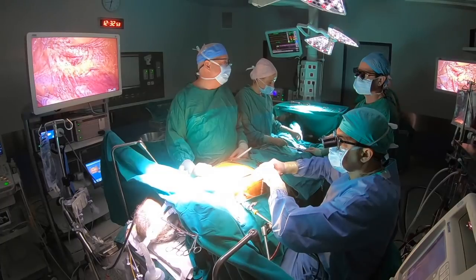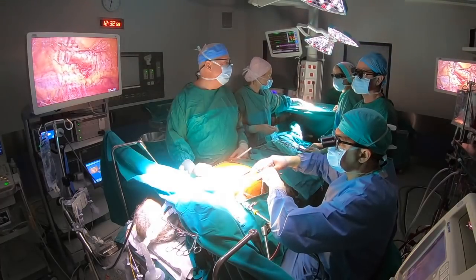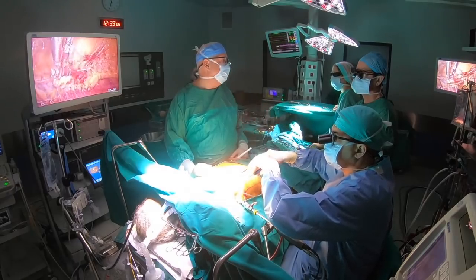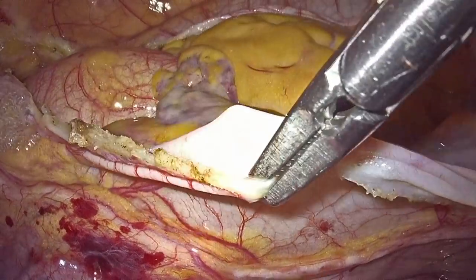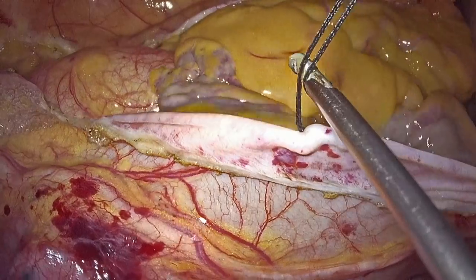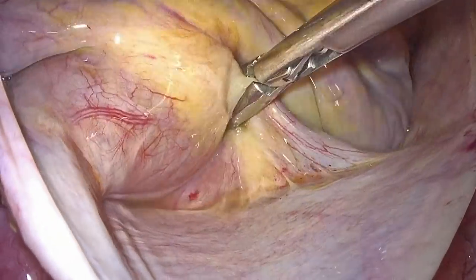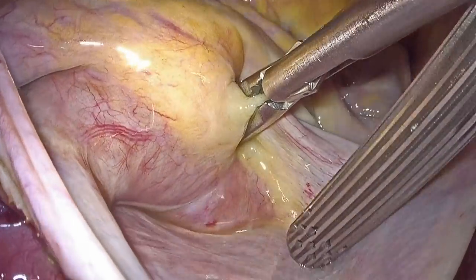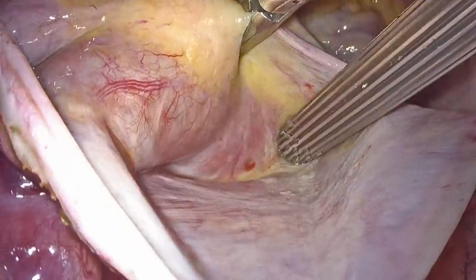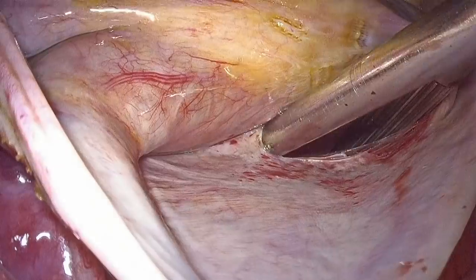The whole operation is performed totally endoscopically using the stereoscopic vision that the 3D endoscope provides. After going on full cardiopulmonary bypass, we open the pericardium from the SVC to IVC, 3 cm above the right phrenic nerve, using diathermy. With gentle dissection, we position the sump sucker in the oblique sinus.